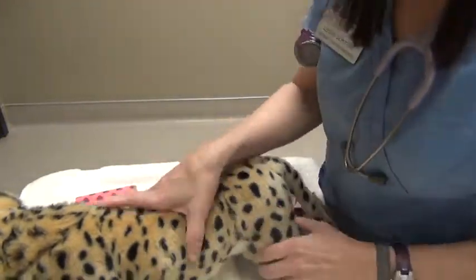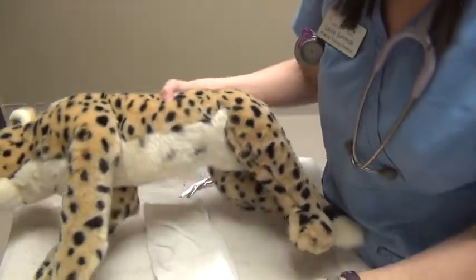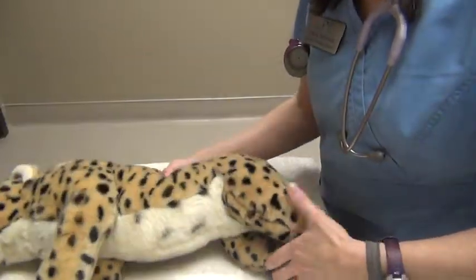We're just going to make sure that everything looks okay under there and our wound is healing, and then that is a simple removal of the abdominal bandage.